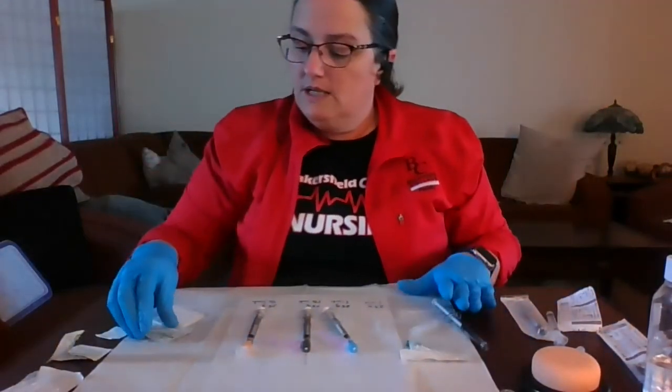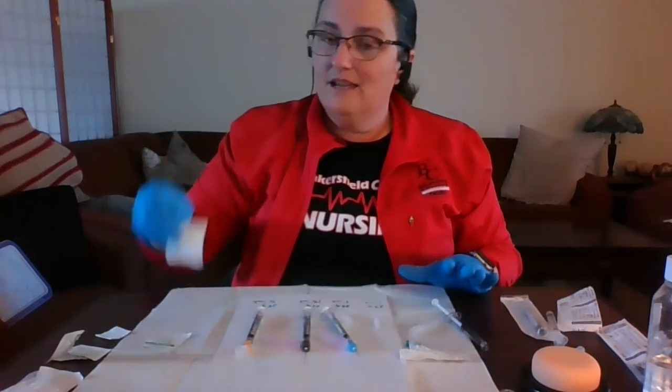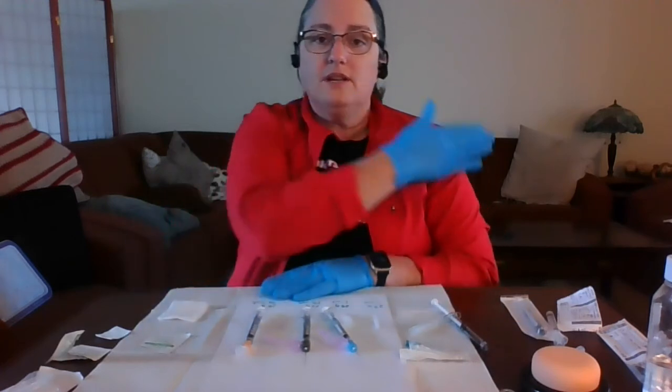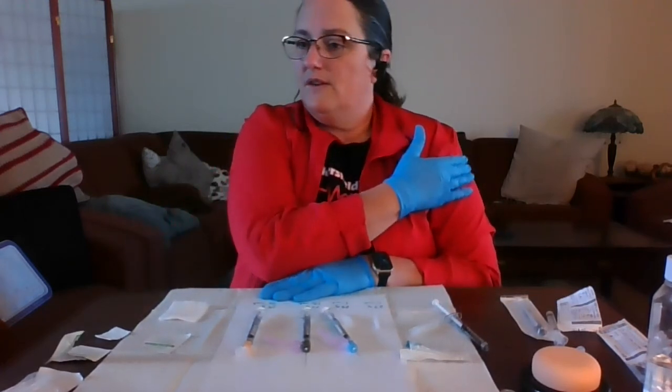You also need, for your supplies, alcohol pads and some sort of gauze or possibly bandages. Once you have given a vaccine, you may have to cover the area if you have a little spot of blood there.